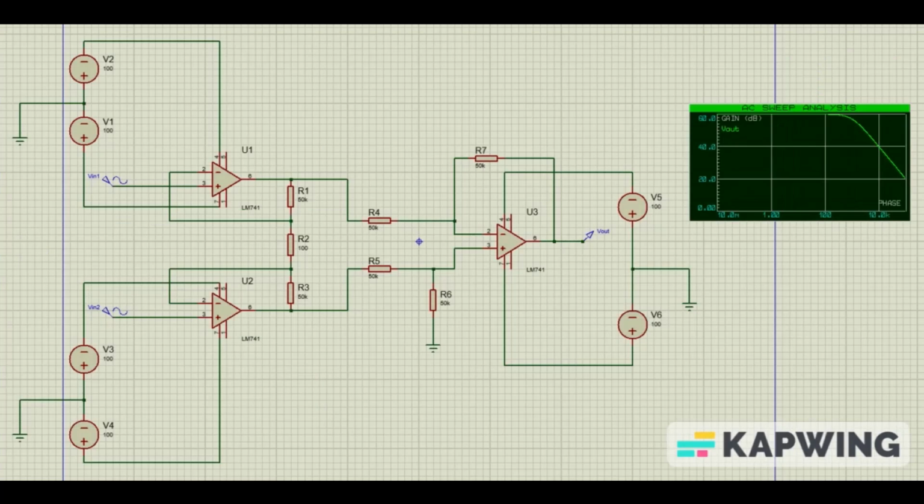Step 3 is designing the instrumentation amplifier. To properly read an ECG signal, we need to amplify it after filtering out unwanted frequencies. Even though we designed the instrumentation amplifier at the third step, we will use it at the first step when we design the overall circuit. We designed it this way because the overall gain of the circuit is partly determined by the band-pass filter amplifier that we used in step 1.